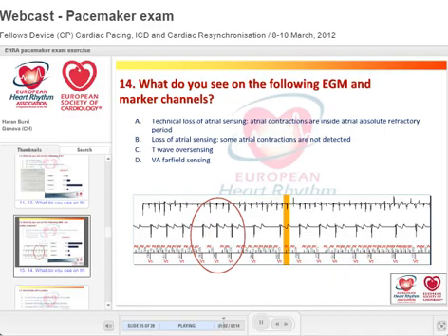The only device where you would see something marked there would be in a Medtronic device, in more recent devices which are built on an ICD platform, where you would see AB, or atrial blanking, actually shown there. But normally atrial blanking means that the device does not even see it. It's something a bit specific for that device.